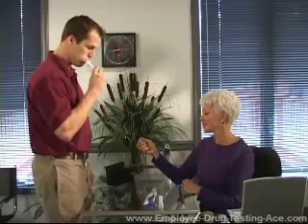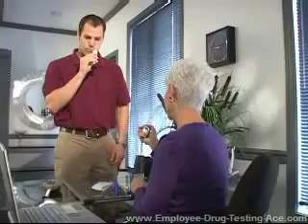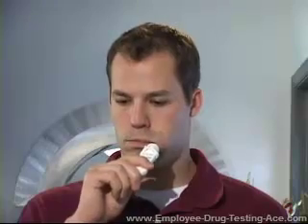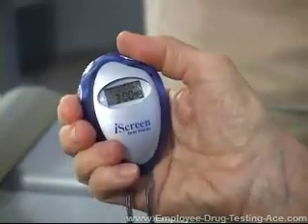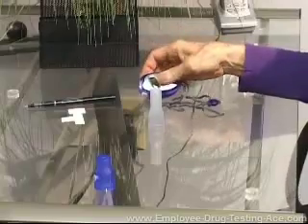Once the iScreen OFD packet is opened, the device should be used immediately. Next, instruct the donor to actively swab the inside of the mouth and gum areas for 3 minutes. During the swabbing process, the donor will notice a softening of the swab as it collects oral fluid. The donor may stop swabbing after 3 minutes or when the swab has become completely soft and saturated.